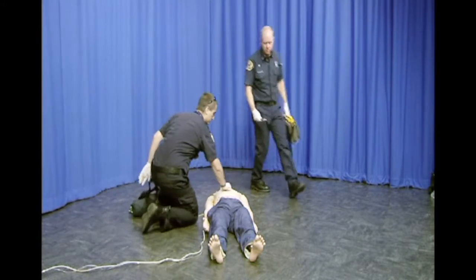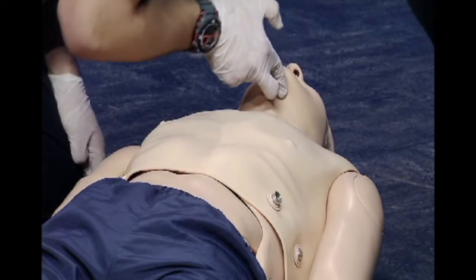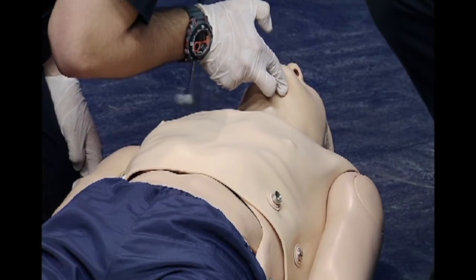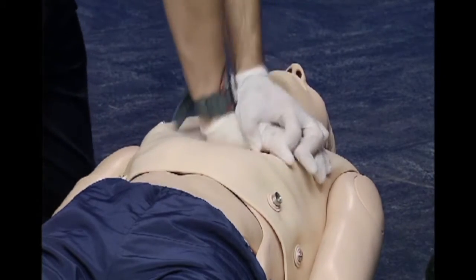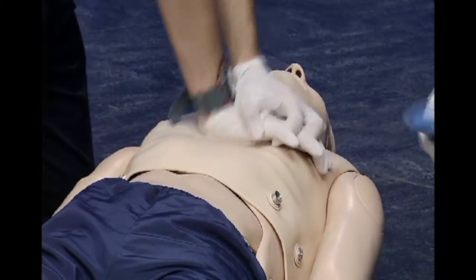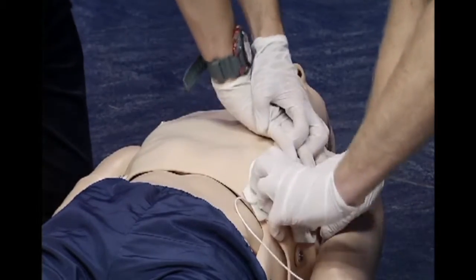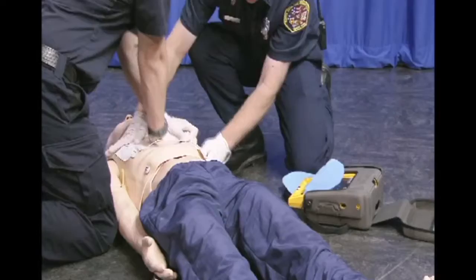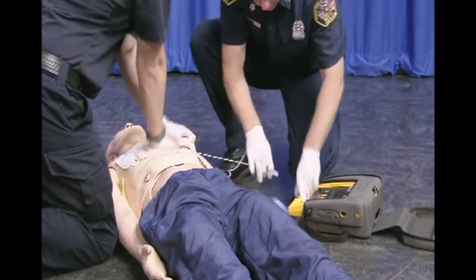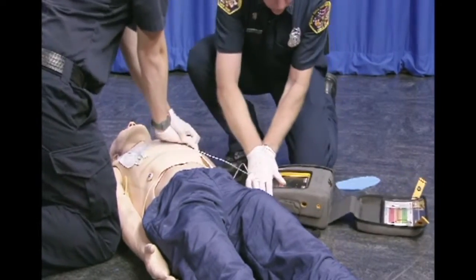When a two-person team arrives first, Rescuer 1 immediately goes to the patient's side and begins to assess the patient's level of responsiveness. If no response is detected within 5 to 10 seconds, Rescuer 1 begins high-quality chest compressions immediately. Rescuer 2 sets a metronome to beat 110 times a minute. Rescuer 2 kneels next to the patient opposite Rescuer 1 and applies the AED multifunction pads to the patient's chest while chest compressions are being done.